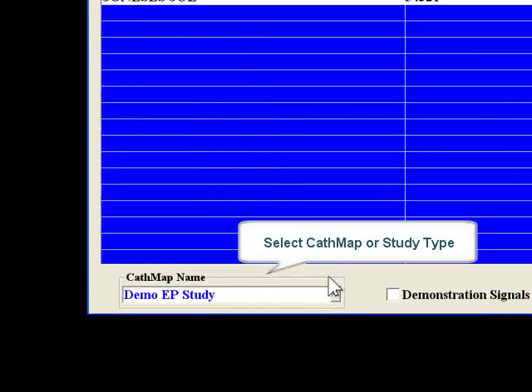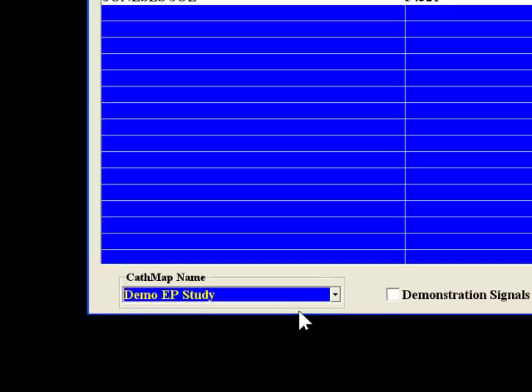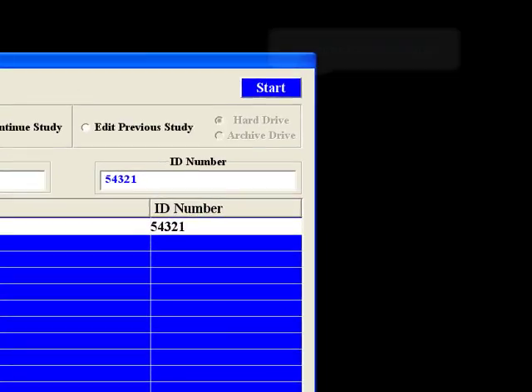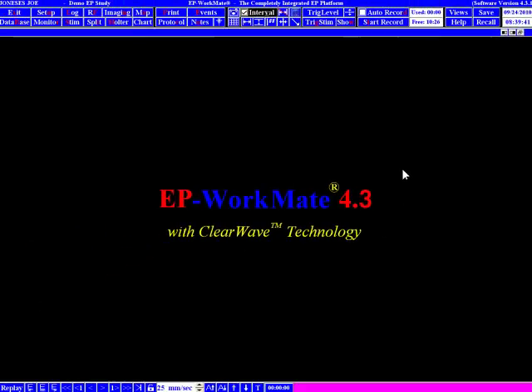The final thing you have to do when starting a new study is to select your cath map. The EP Workmate Recording System considers a cath map to be the study type. If you're coming into EP Workmate Recording System to practice or learn about some features, you can turn on demonstration signals by clicking the Demonstration Signals checkbox. This will give you electrograms that look real in order to practice measuring, recording, printing, etc. When you have chosen all the options and you're ready to start the study, click the Start button in the upper right corner. This will load the patient data and cath map and start your study.